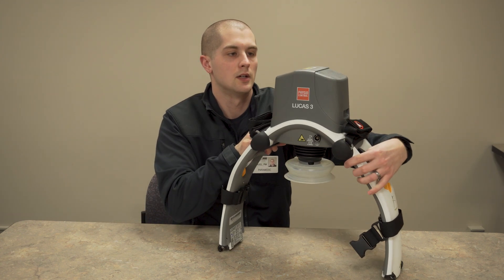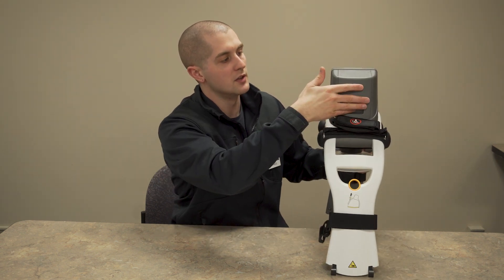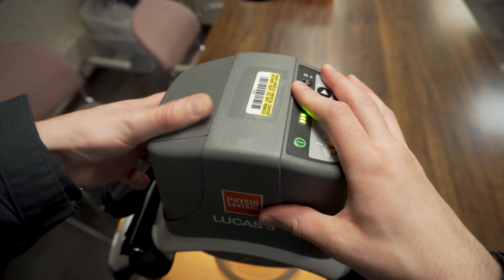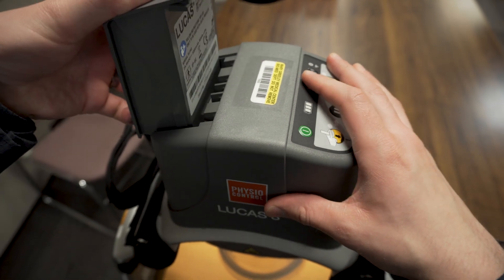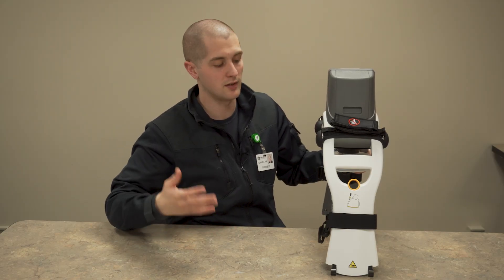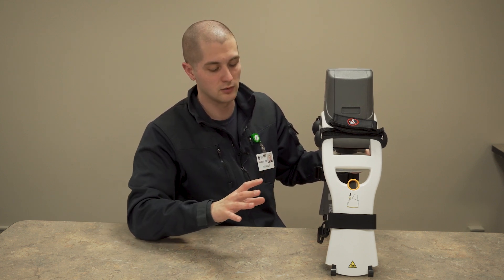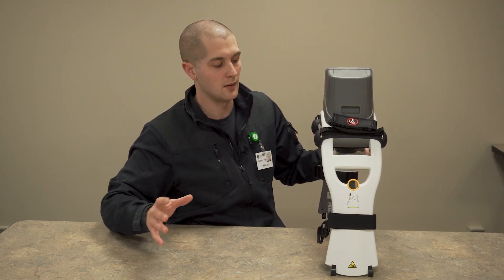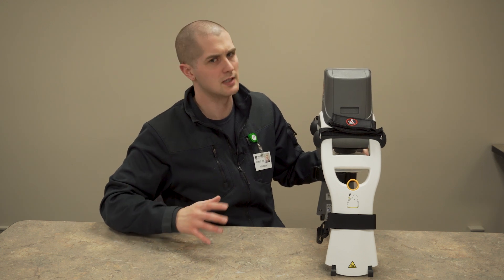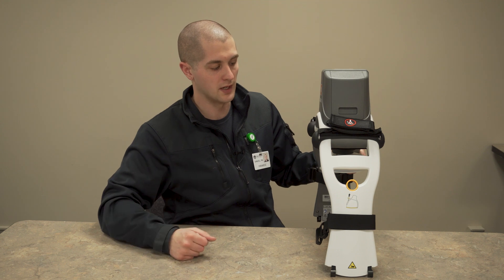On the back, you have your battery compartment. This battery is really simple to take out — just pull out and up. The battery will come out and you can replace it. If you replace it while it's running and do so within 60 seconds, it will save all the settings in the Lucas and all your code data, and you won't have to reset anything. If it takes longer than 60 seconds, which it really should not, you're going to lose the data and have to start from the beginning.